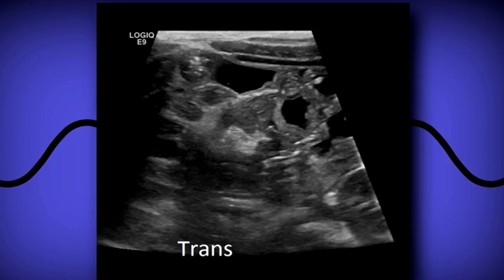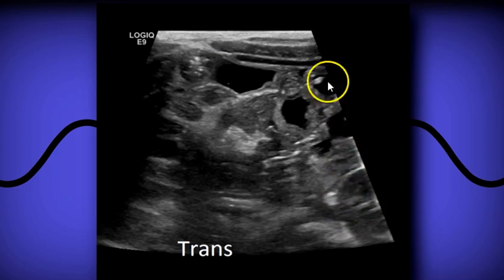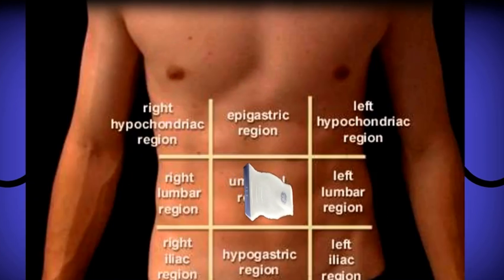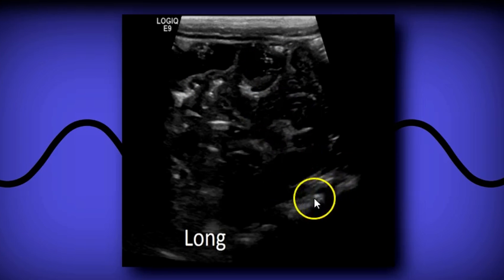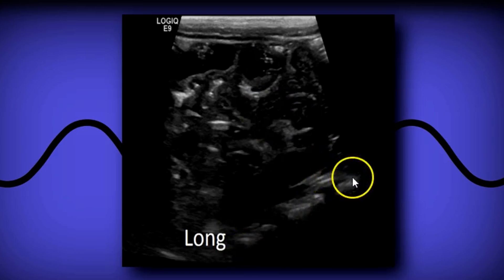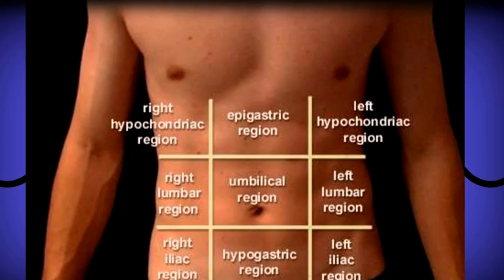After that we go to the umbilical region, where you can have some small bowel — you can see a little piece of the kidney and small bowel here. In sagittal you'll again have some small bowel, and you can see the vertebral bodies right here. That's pretty much your protocol for an abdominal limited scan or an abdomen scan for intussusception.